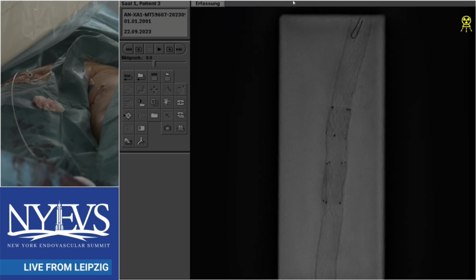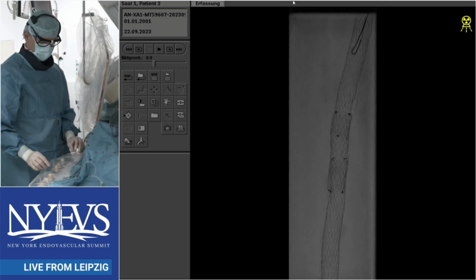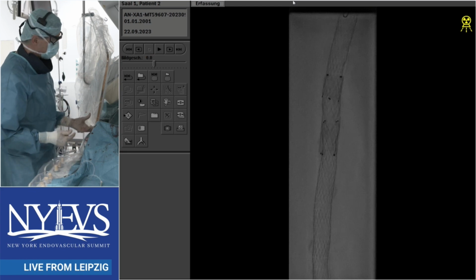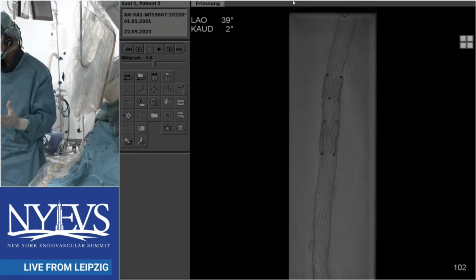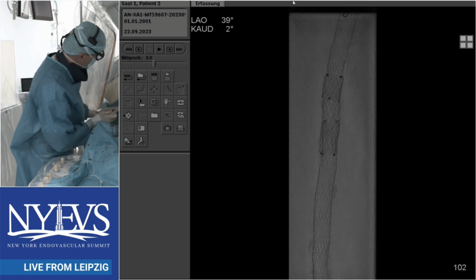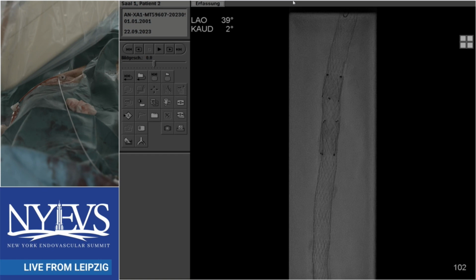You also have a button where you can make this spiral turn the other way around to release any struts if they're hooked into the catheter. So it has never been a risk. Of course, sometimes in these very fibrotic areas, you have to pre-dilate maybe and then continue with Rotarex. But it's completely without risk.